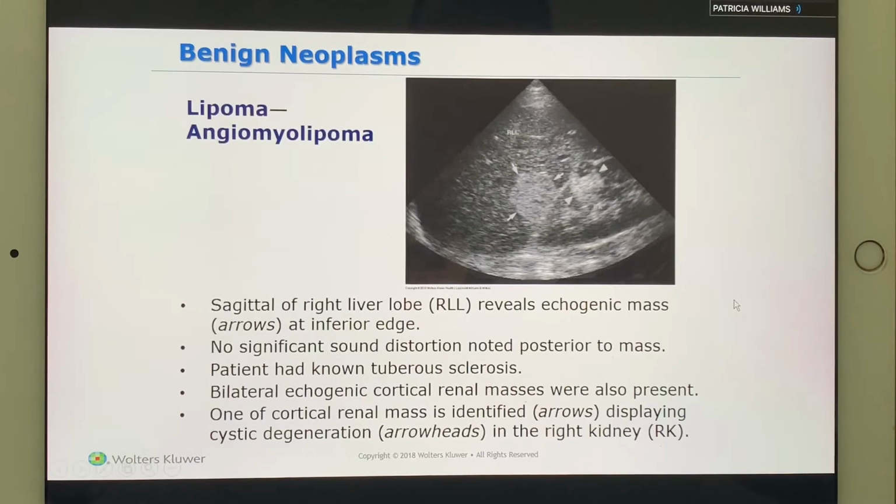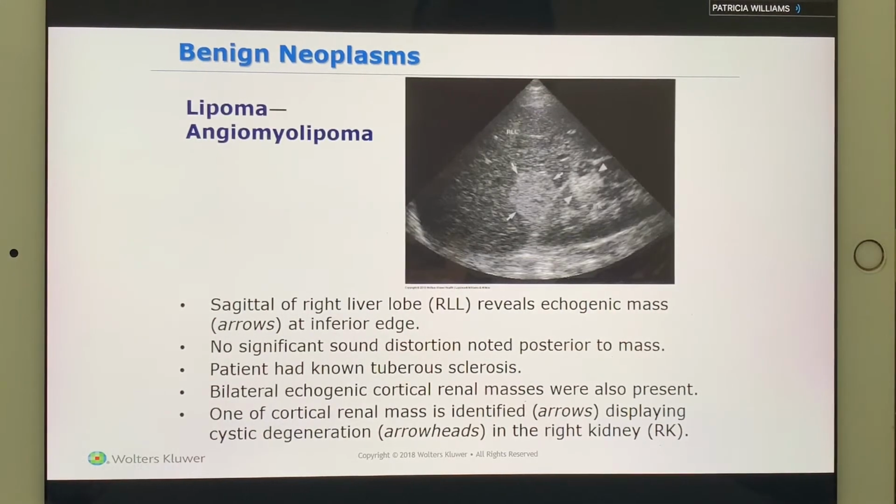Is that an appearance of a core biopsy taking place in there? Will they do a core biopsy? That I don't know. I was looking at the echogenic line going through the mass. Do you see that? Yes, I do. I was just wondering if they were doing a biopsy there.